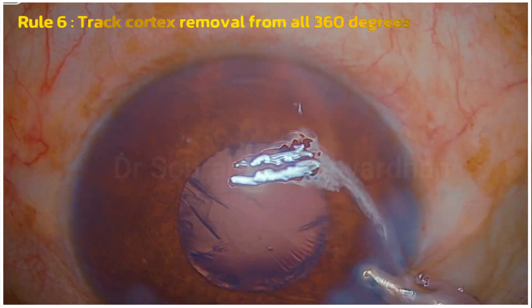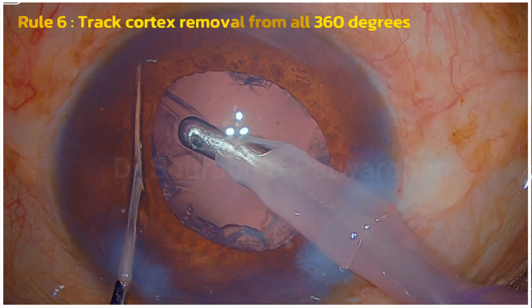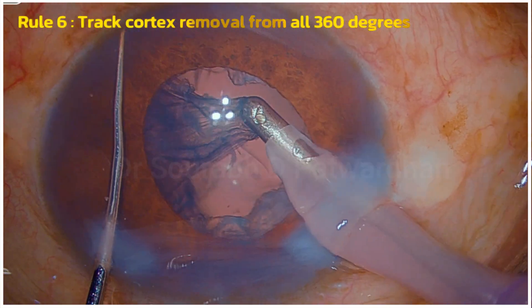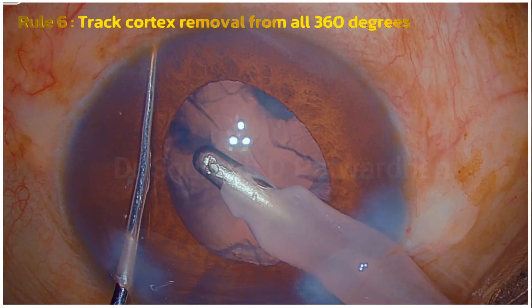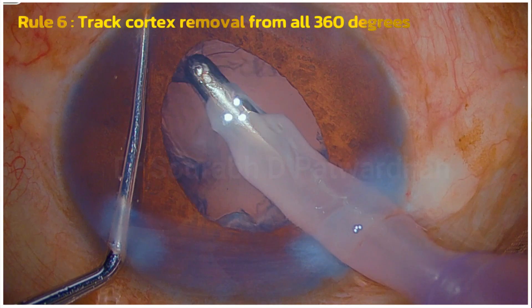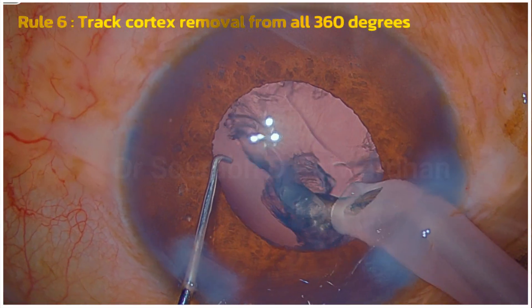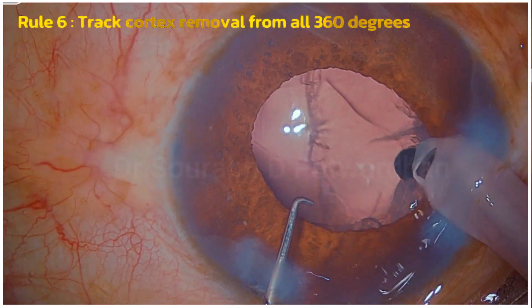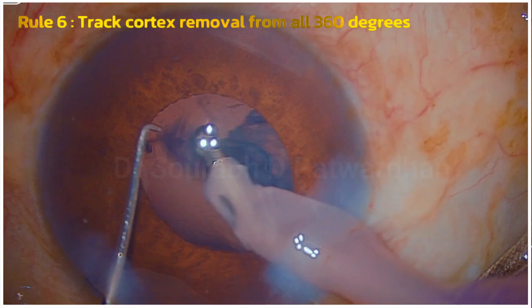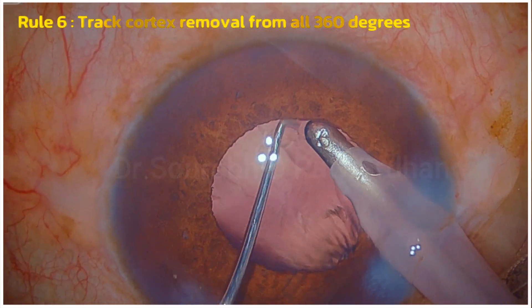During cortex removal, because you cannot see the peripheral cortex completely, you must mentally track that all 360 degrees of cortex is completely removed. You can use the Patwadhan chopper — which has a blunt end — to easily retract the iris and pull out the cortex. I am tracking this cortex all around, pulling it from the anterior leaf right to the equator. If I have any doubt, I can retract the iris and check the periphery for any residual cortex.